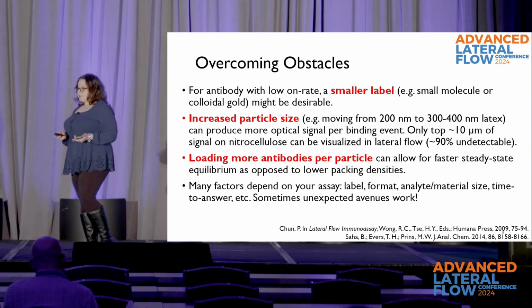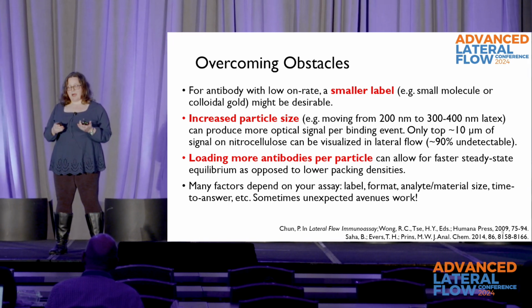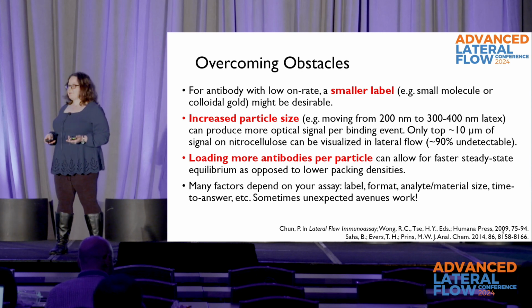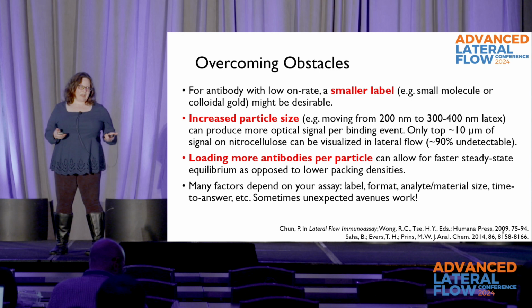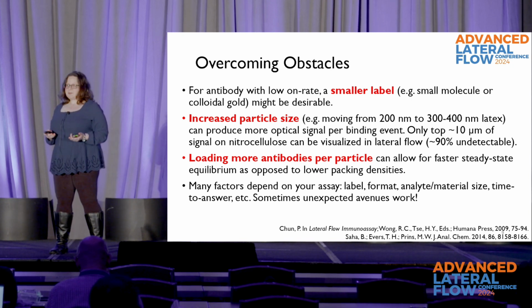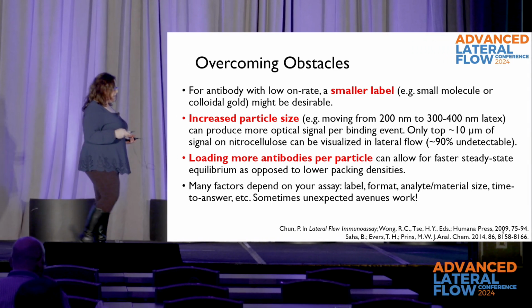You could switch to a biotin-avidin system where you have an in-solution biotinylated antibody and an avidin at your test line. That's definitely something that would help your sensitivity. But it really depends on your pair of antibodies. Switch your antibodies around. Try a different pair. These are things that we do routinely at DCN all the time for assay development.